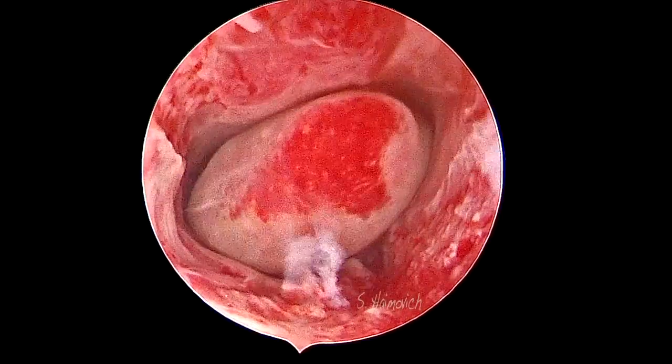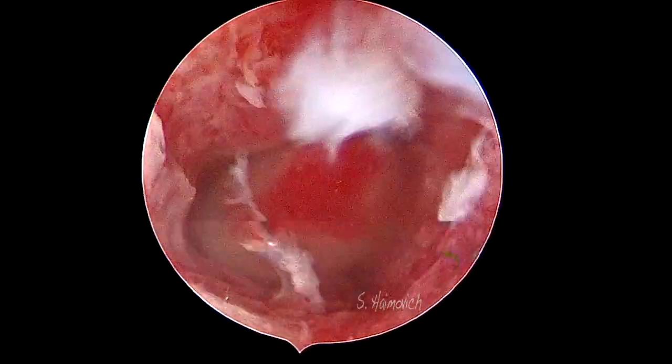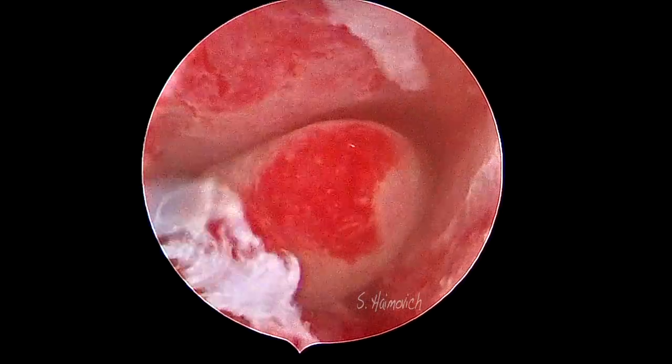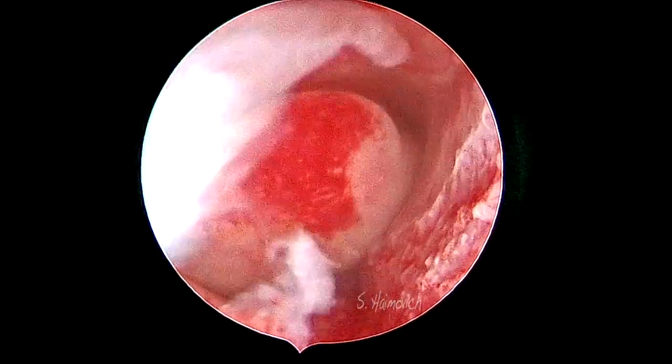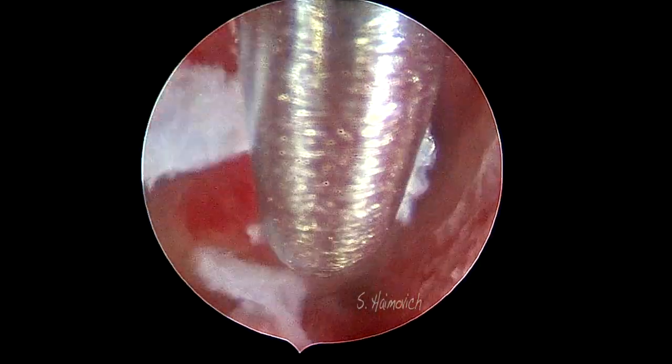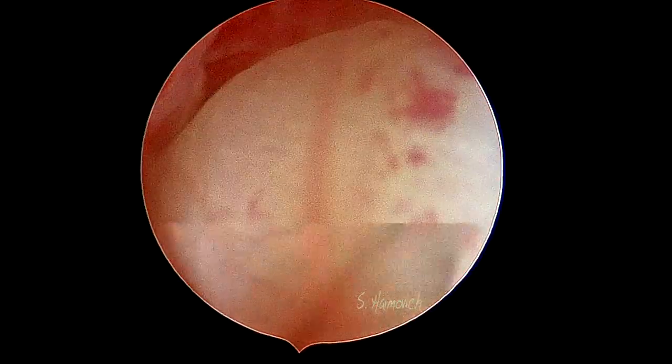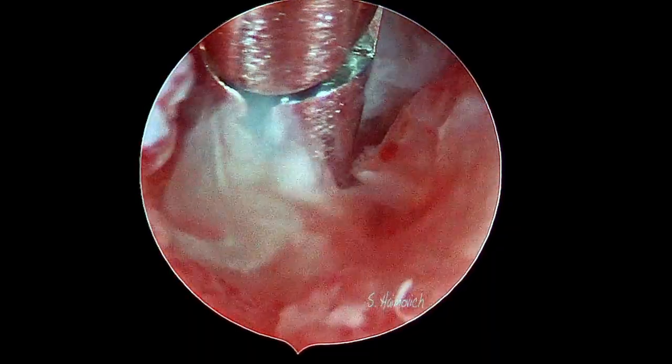The reason blood is seen is due to the low pressure during the procedure, to avoid the patient's discomfort. Once the polyp is free, we bring the grasper. The only thing left to do is to catch the polyp and pull it out.